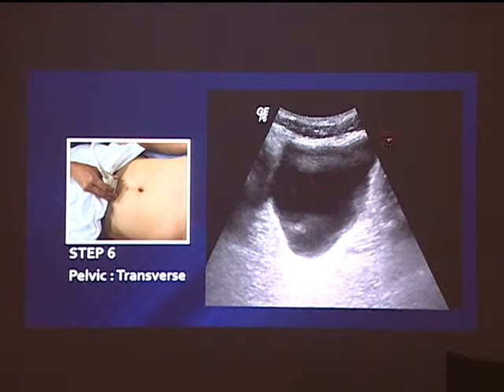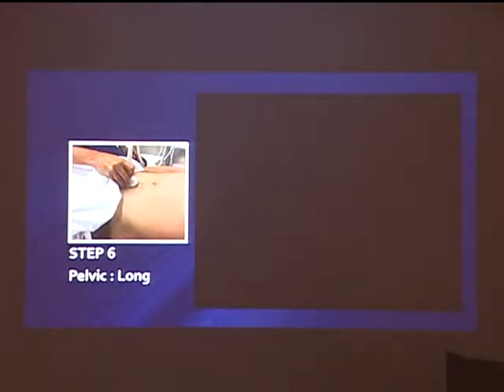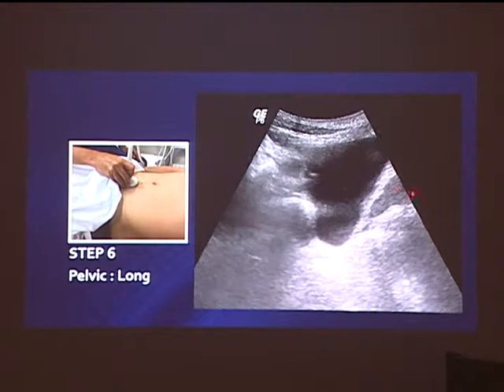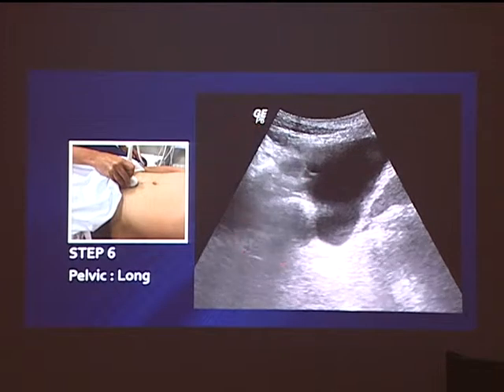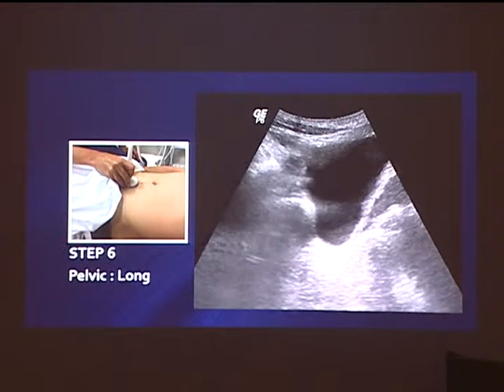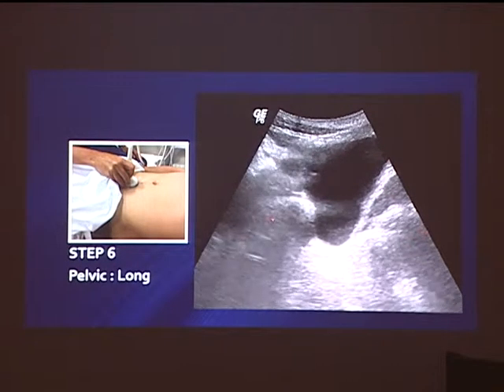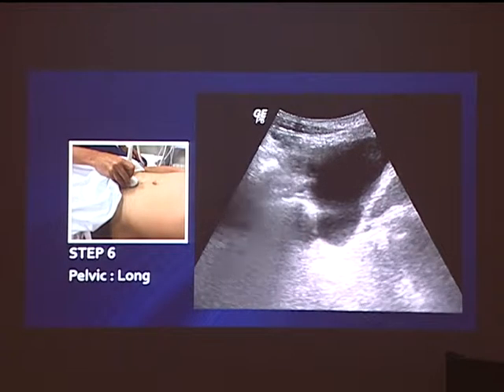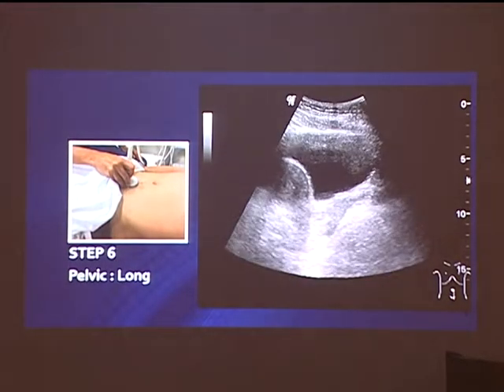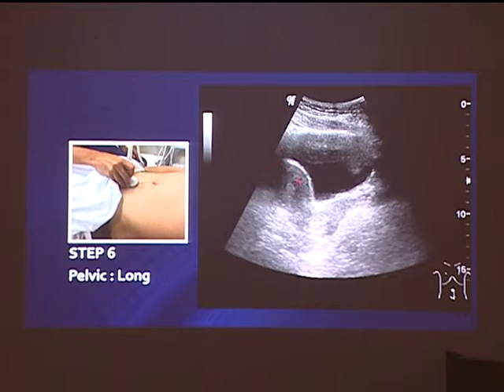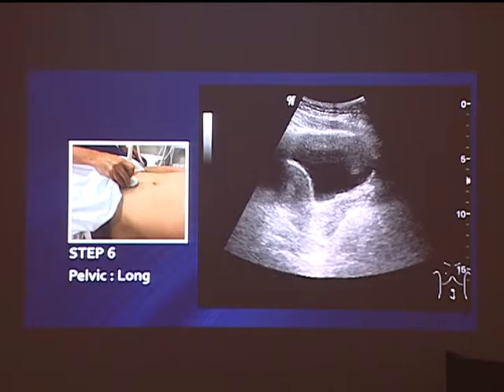For the pelvic view — first the transverse view — you see a distended bladder, and there should not be fluid outside. Longitudinal view: bladder — this is a male patient — there should be no fluid around here; these are just bowel gas. For this view to be successful, the bladder must be distended. If the bladder is collapsed, all the bowel gas will come in and you will not be able to appreciate any fluid that collects there.